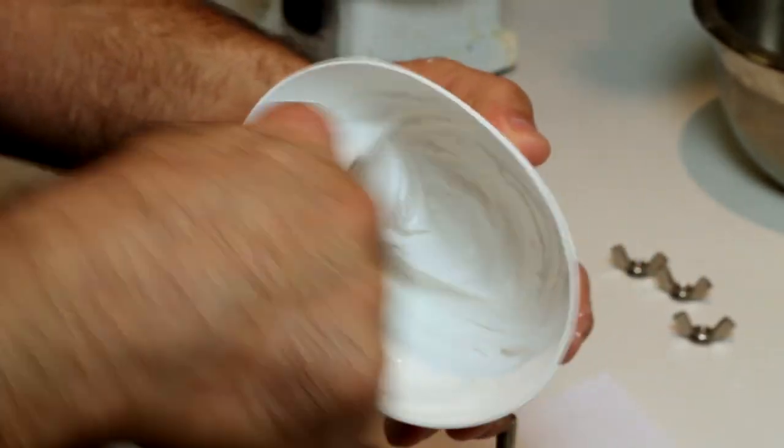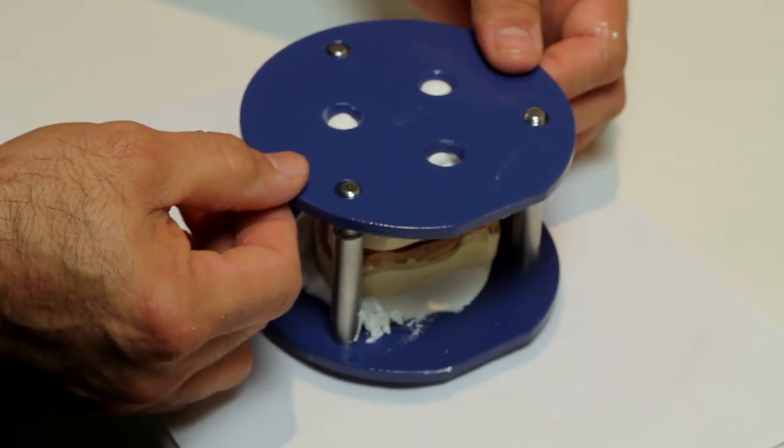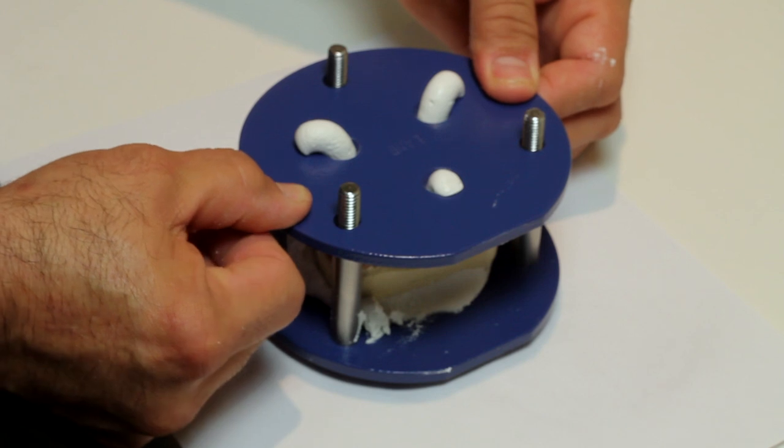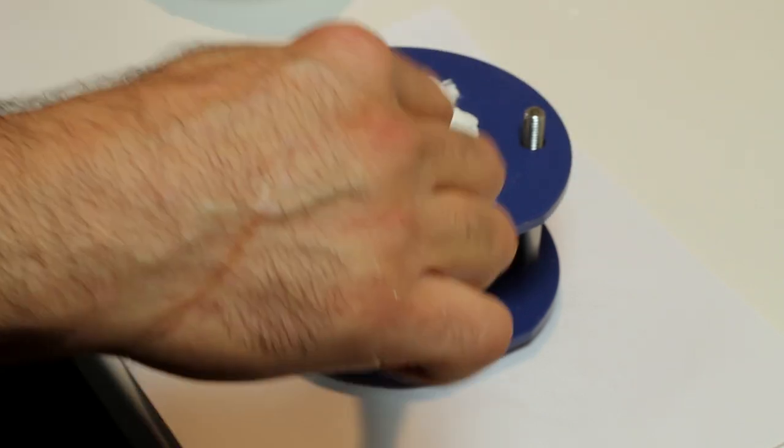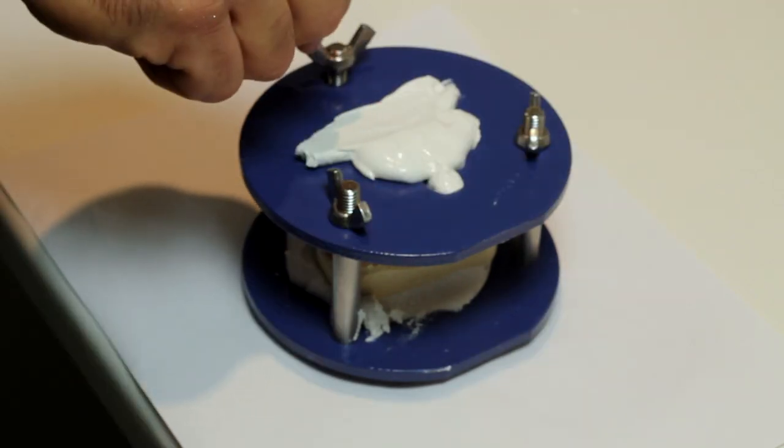Mix more plaster. Add plaster to the top of the index all the way up through the hole in the upper member of the jig. Smooth out the plaster that's expressed through the hole in the upper member. Tighten the wing nuts all the way down. Let it set.